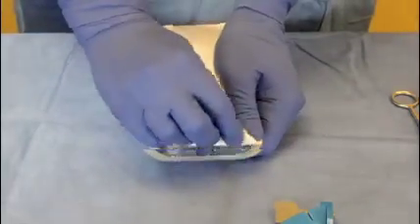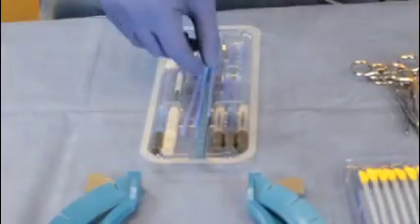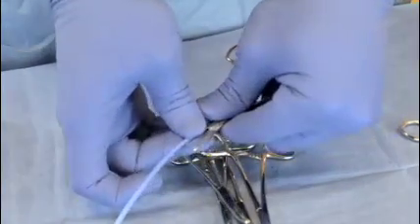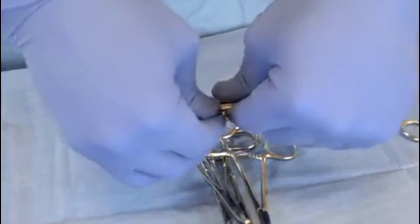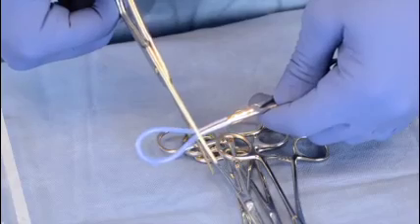Cover 8 mosquito hemostats using these 13-centimeter strands of blue tubing found in the accessory kit. Place blue tubing on both jaws of the hemostats to completely cover serrated surfaces. Clamp the jaws together until the first click. Trim the tubing at the jaw tip with sharp, clean scissors.